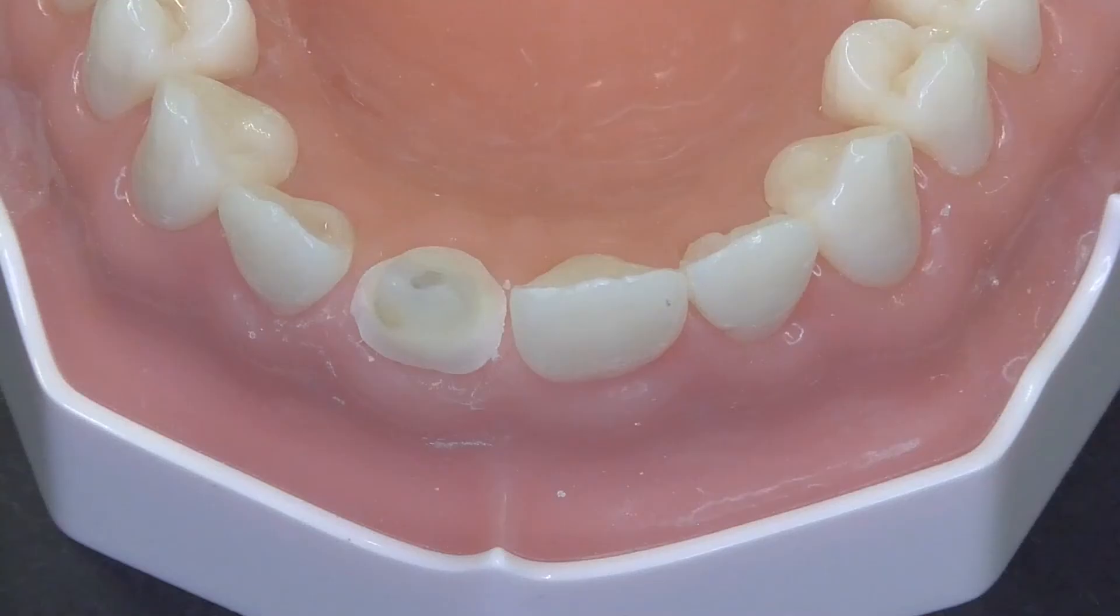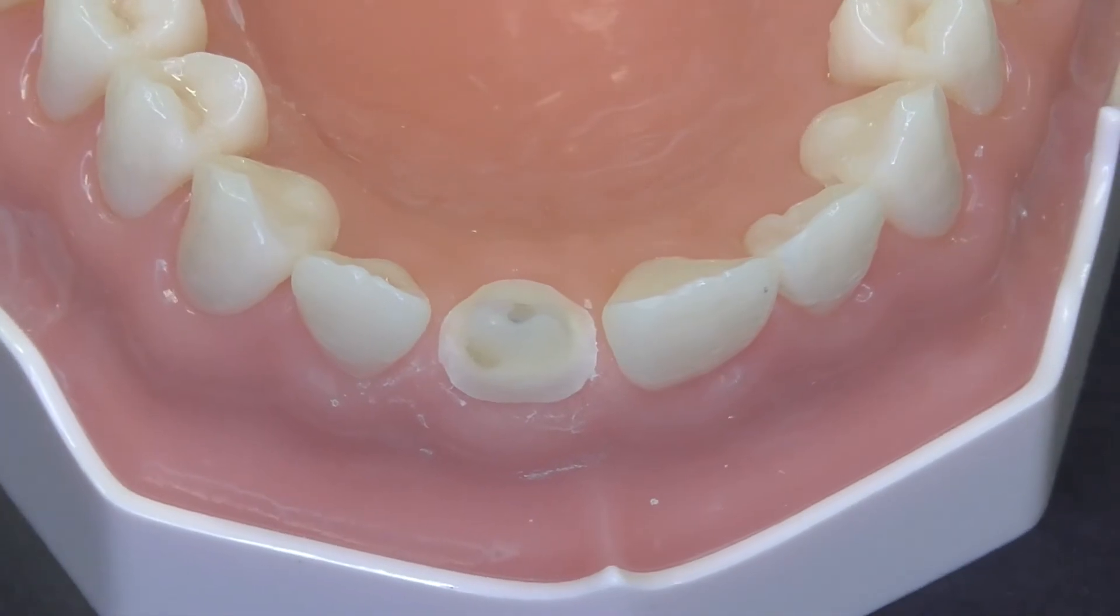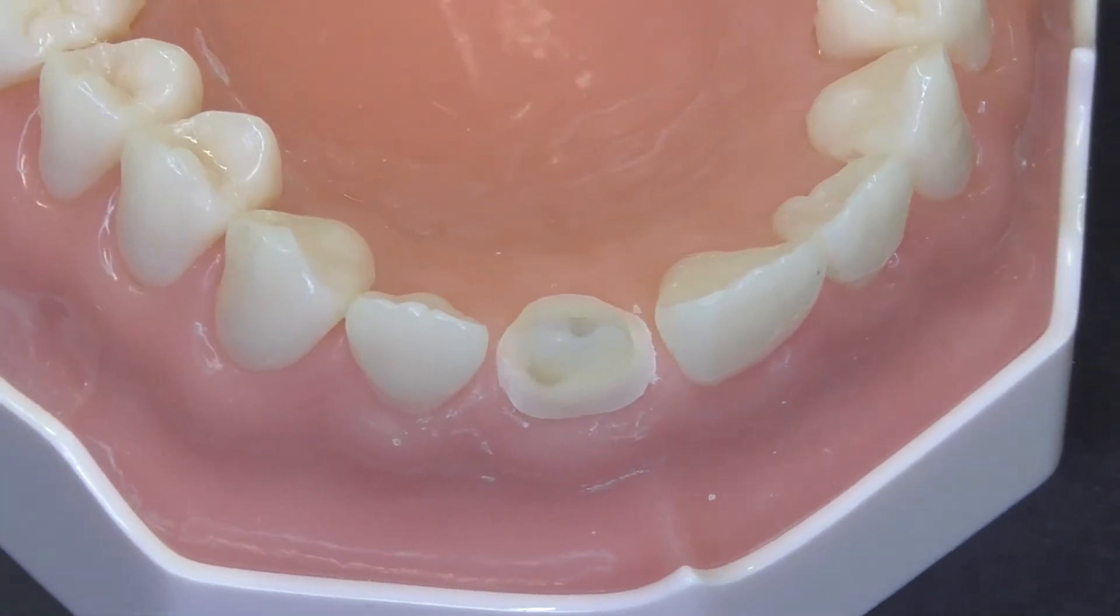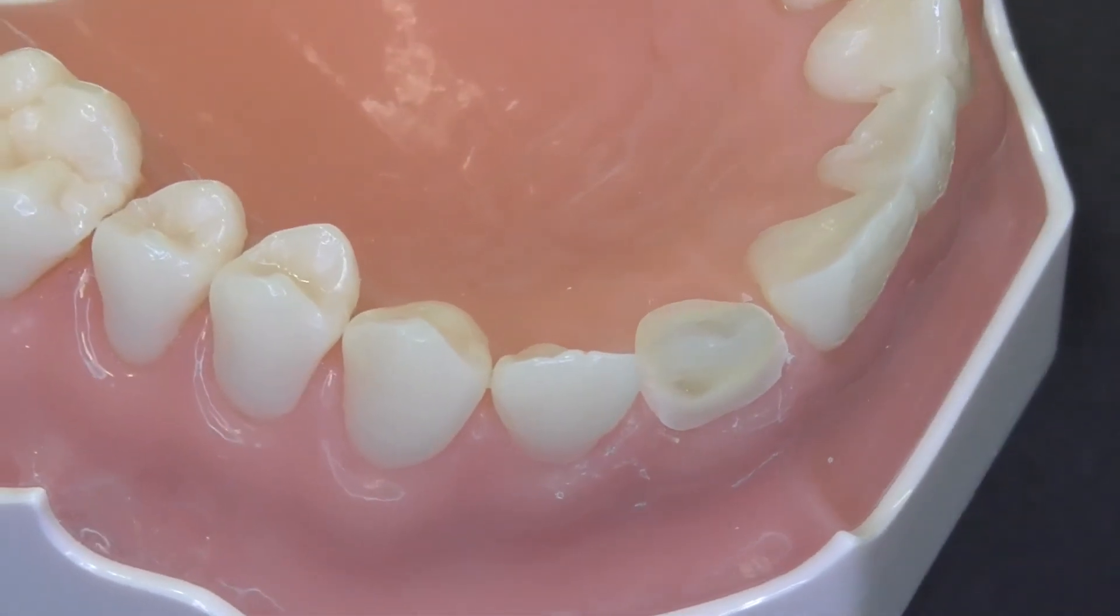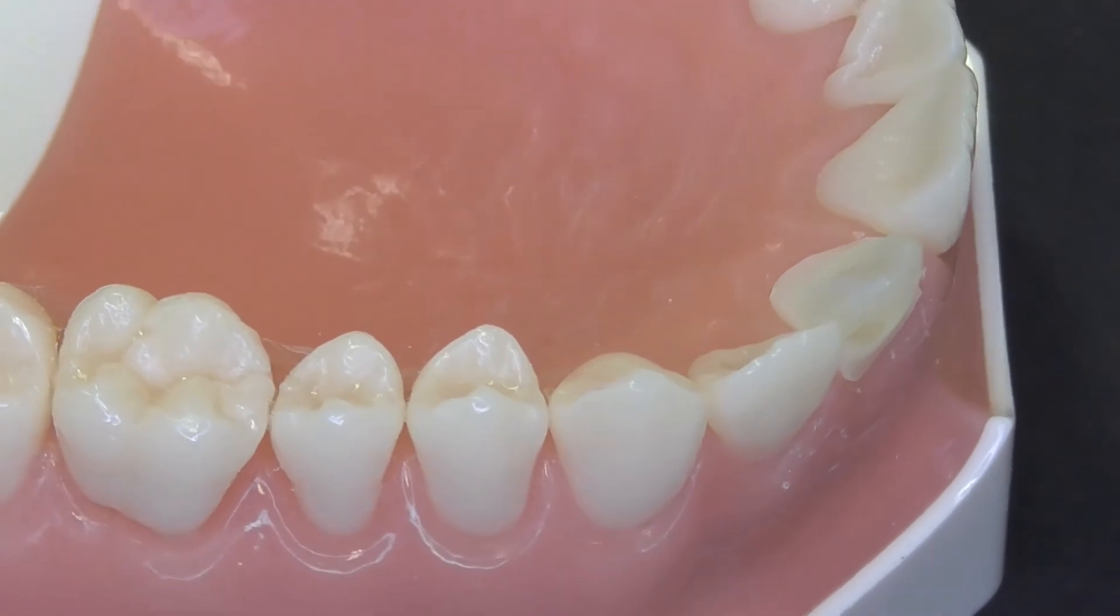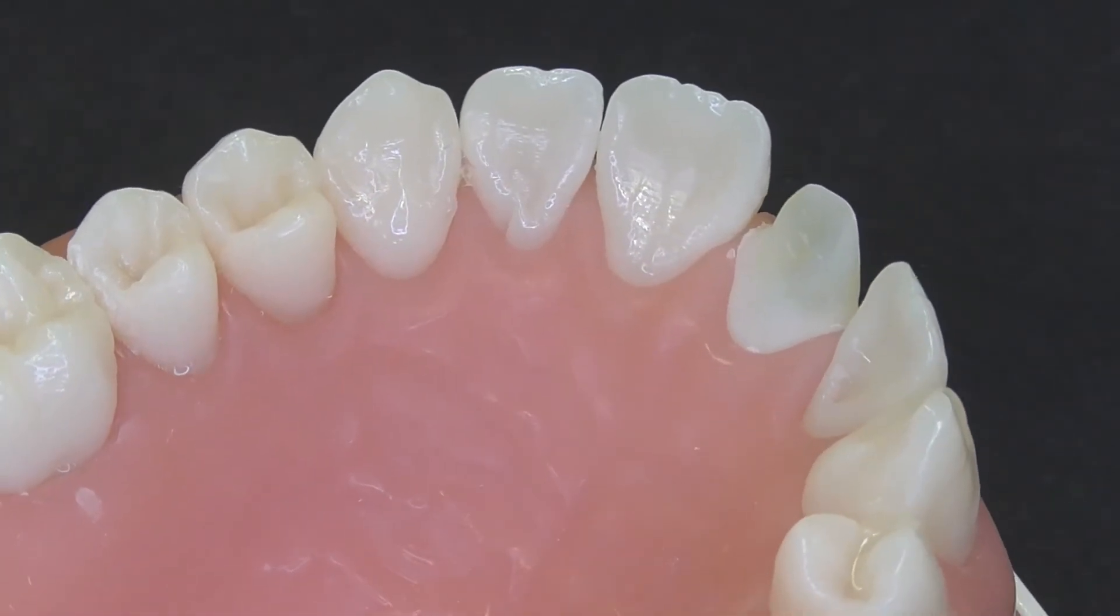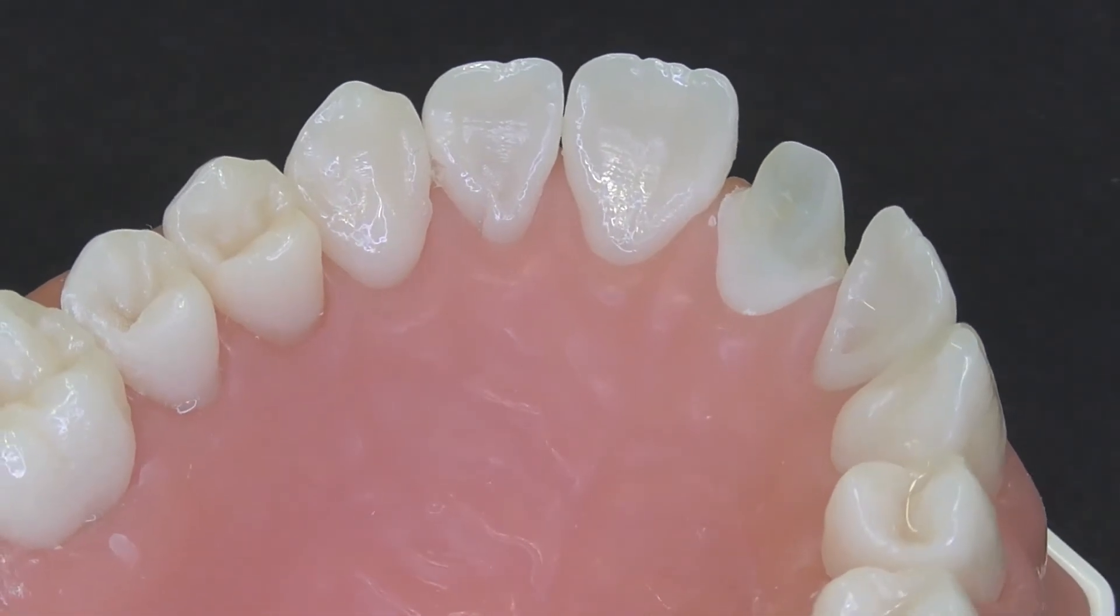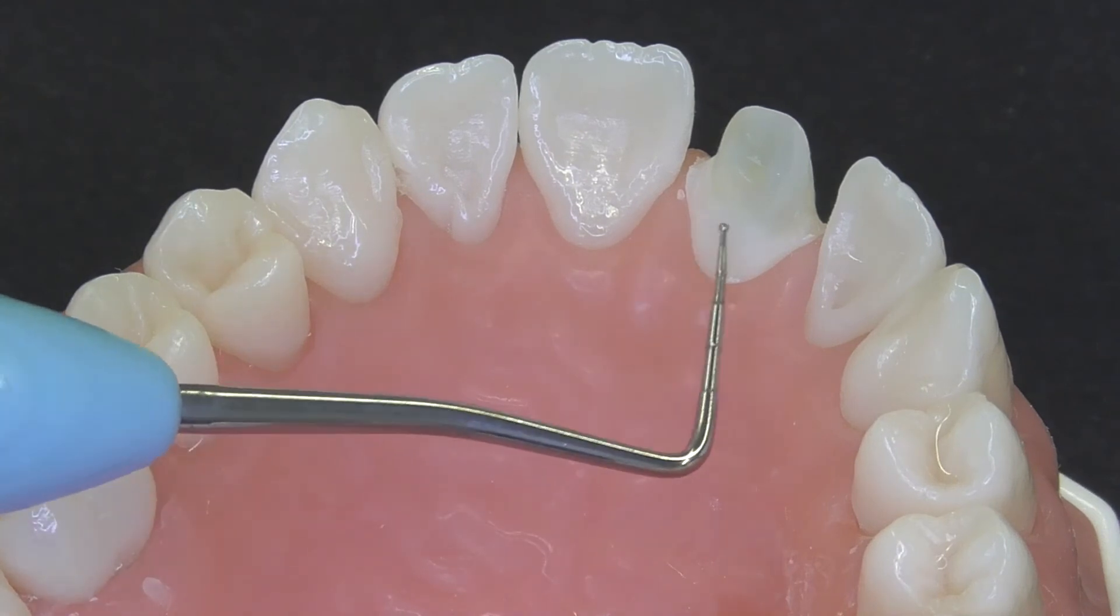In this case, we have optimal loading of fiber reinforced material in the root canal, which enables the post system to work as an internal ferrule design for the coming crown system, which can be made out of ceramics or composite.